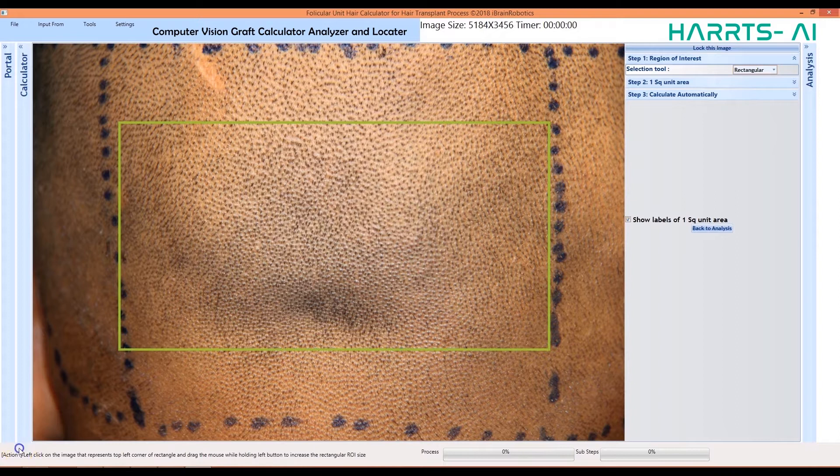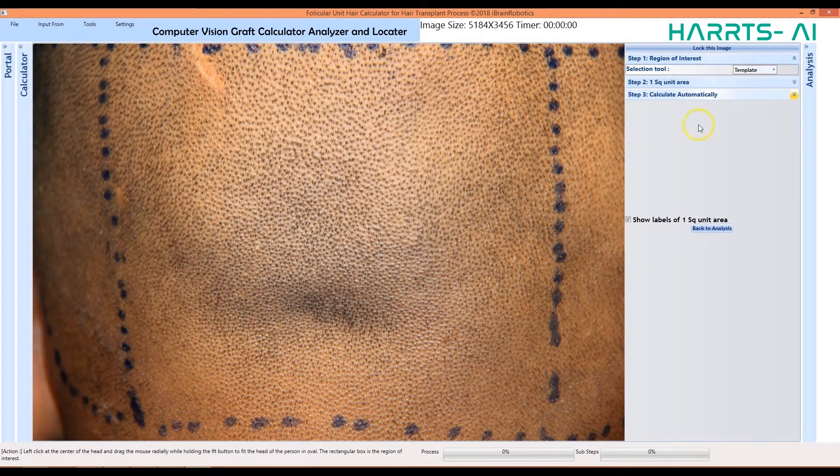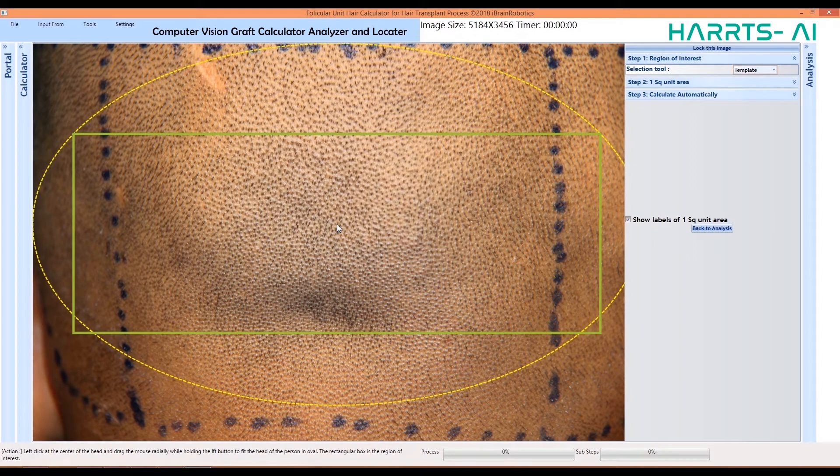For using the template tool, simply click in the center of the area of interest, and the tool will auto-select the area of interest. You can also readjust this manually if you wish.